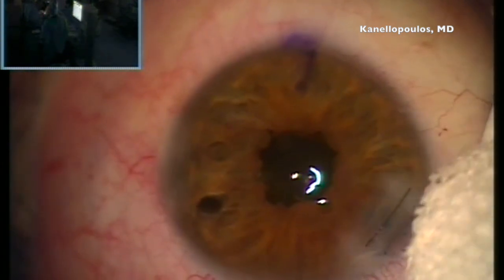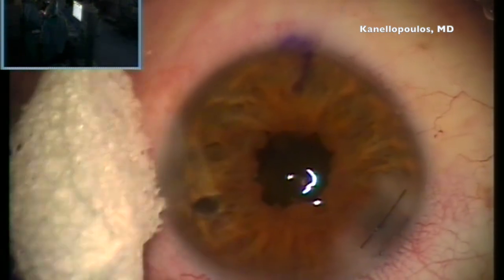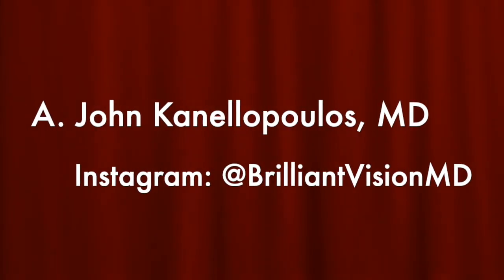and we can see how elegantly it keeps the eye watertight after cataract procedure, and how we have finished this very challenging case without traumatizing the iris much. We resolved the pupillary membrane, the very, very advanced cataract.